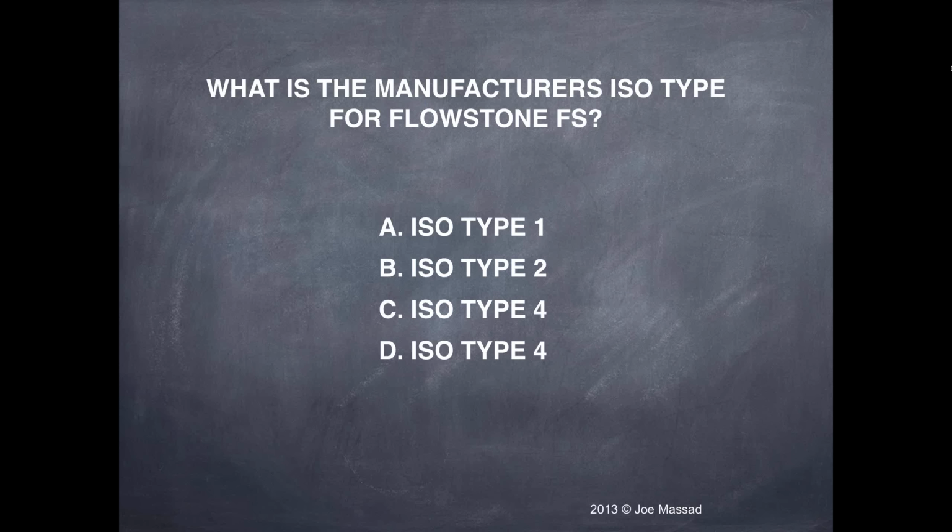I would recommend using Columbia cheek retractors, the little metal ones. Have the patient assist you in retraction. Let the patient know it's going to be warm. You go from the water bath straight to the mouth. Inform the patient before you get there they're going to suck and smile or whatever. And on the bottom, they're going to do very similar.